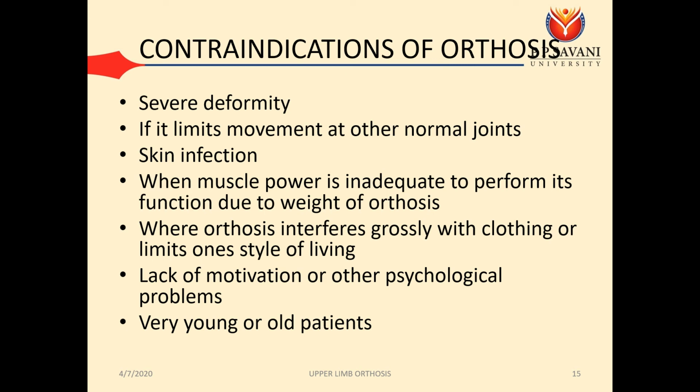When orthosis interferes grossly with clothing or limits one's style of living, this is subjective to such patients whose style of living is such that the orthosis cannot be used, very subjective. Lack of motivation or psychological problems: if the patient is not psychologically stable, there is no meaning of giving orthosis, it will not produce the role that it is supposed to.